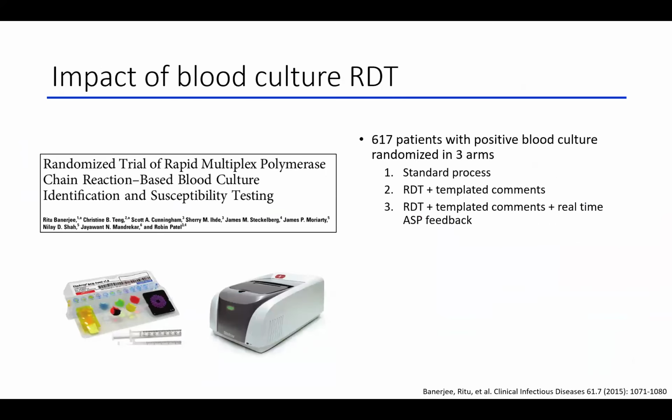And the first one I included because it is my favorite, even though it's from 2015. And this is using the BioFire BCID assay. And the reason I love this manuscript is it was the first time I saw a randomized control trial where patients within the same hospital got different rapid diagnostic testing access. And it was just so well done. It's a favorite. I got to include it. So this was done at Mayo.